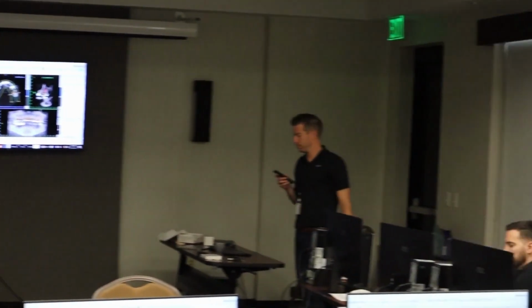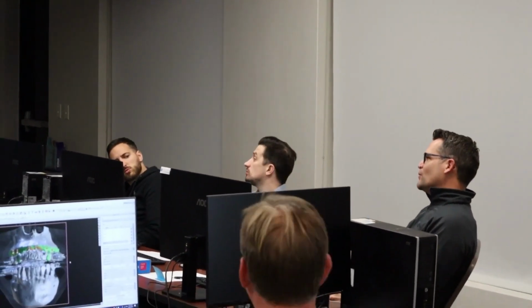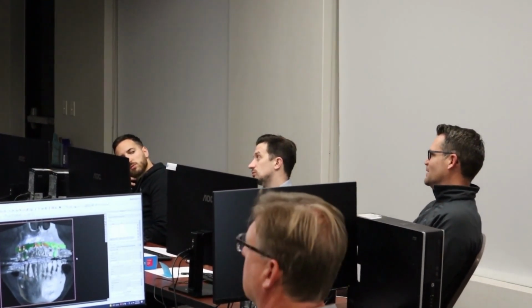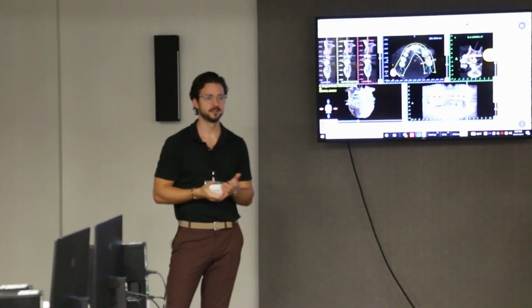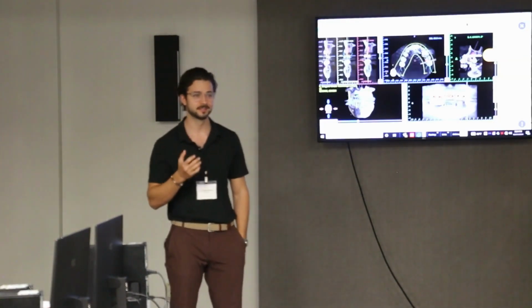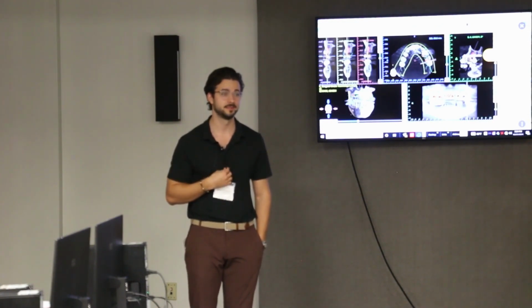So you said completely edentulous patient. I'm guessing thin ridges, right? Really thin, yeah, in the maxilla and mandible. One side was atrophied away and the other one was there. We're talking 7-8 millimeters thick. It's tough to work with that. I couldn't get it to reflect at all. In my experience, the most you can do is try to get as deep as possible past the periosteum, because the periosteum holds it up so much, and use releasing incisions. That's pretty much my best guess.